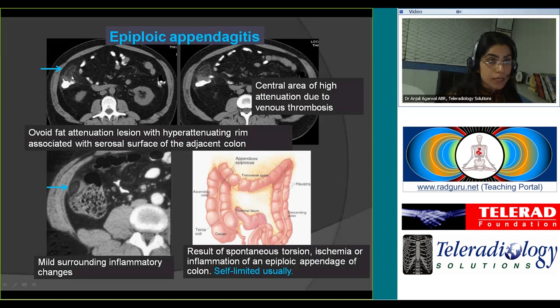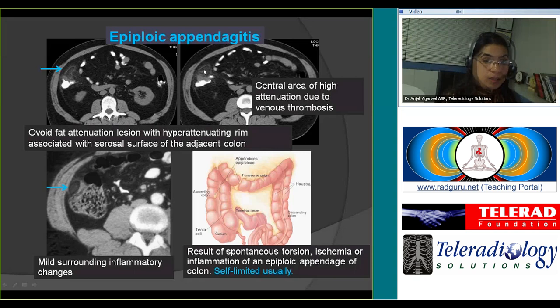This is a finger-like fat attenuation lesion with a hyperattenuating rim associated with the serosal surface of the descending colon. Notice there is mild eccentric wall thickening of the adjacent colon. You may also see a central area of high attenuation — that's the thrombosed vein as a result of torsion or primary thrombosis — with adjacent fat inflammatory changes.